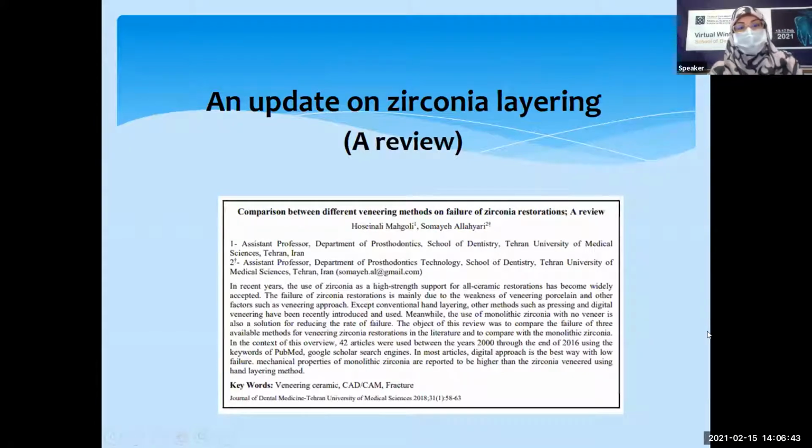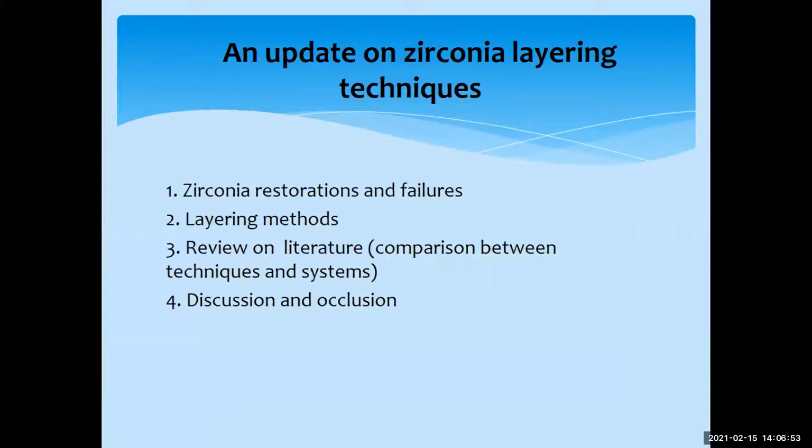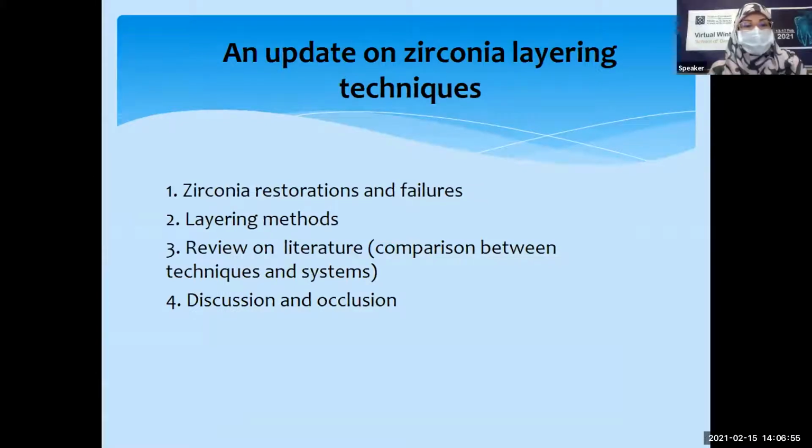My lecture is about zirconia layering. Actually, it is an update and a review that I had written before. During these slides, we go through 4 items. First, introducing zirconia restorations and failures. Second, layering methods. Third, review of literature. And finally, a discussion and conclusion.